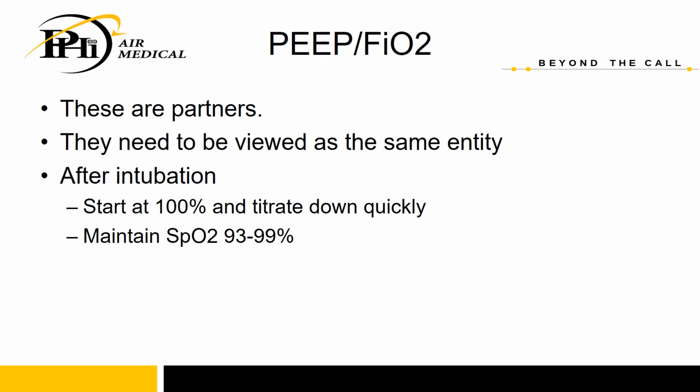The last setting on the ventilator is our PEEP and FiO2. These are partners and they need to be viewed as the same entity. Please, please, please do not leave your patient on 100% FiO2 for a 45-minute transport. It is toxic for our patient and very hard on their alveoli. You have increased incidence of ARDS with patients who are left on an FiO2 of 100%.